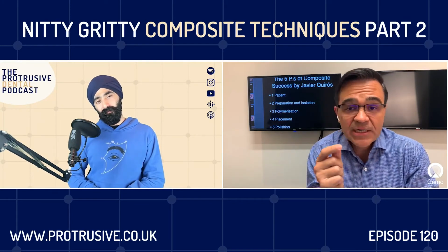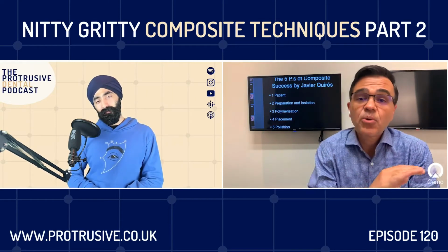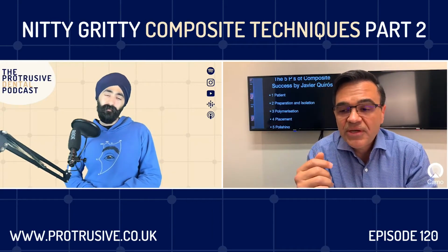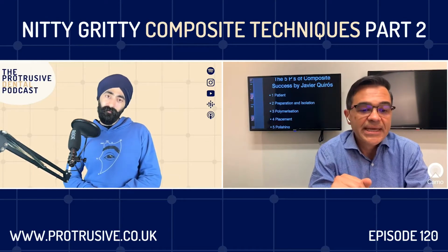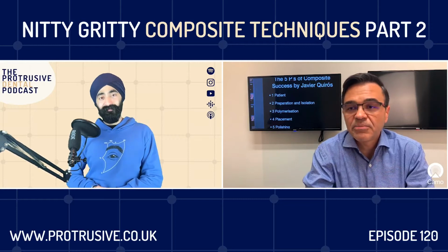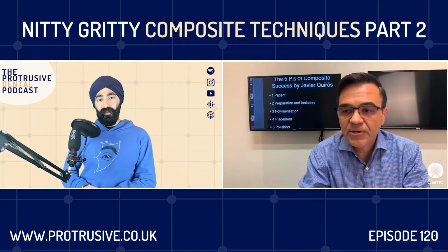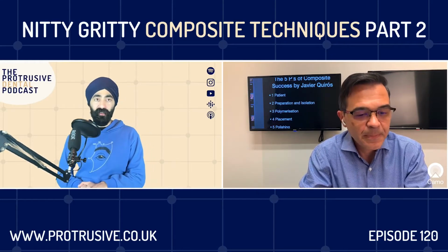We can do that technique for a class 4 or to close a diastema, or we can do that technique with also a full mouth rehab of 28 teeth. So it's something that we use every single day. And nowadays with digital dentistry, we first digitally design it and then print it out, and then you make your matrices on printed models as well. So like I told you, you can do it both ways, either the analog workflow or digitally, which is very exciting.